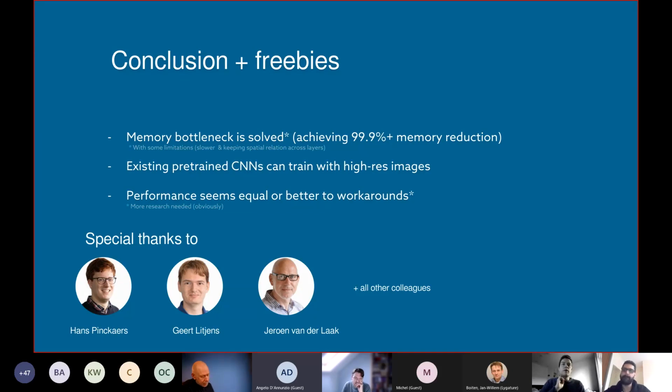Yeah, so maybe I skipped over that one, but I think what really helped is that we used pre-trained weights from ImageNet. So in the case of Camelyon, we only have 270 images to train. It was more or less fine-tuning, considering that we did use a ResNet 34 with pre-trained ImageNet weights, and I think that already helps a lot.